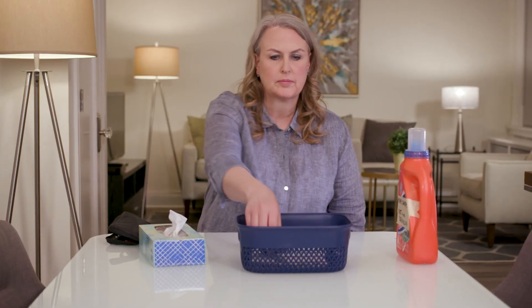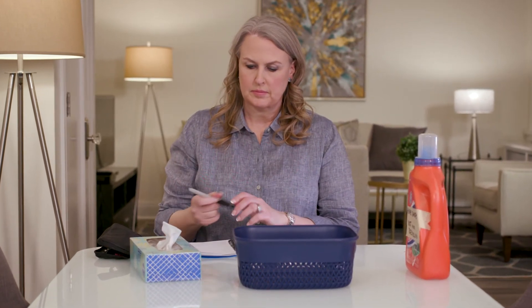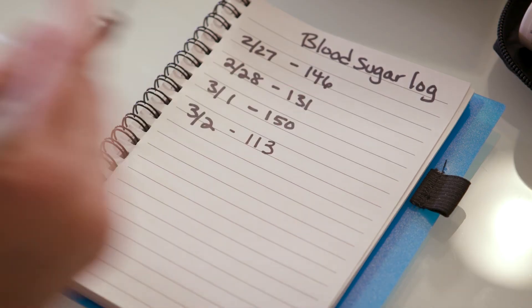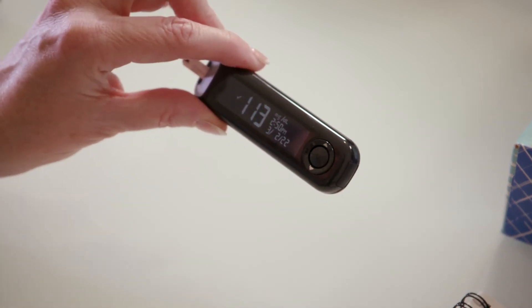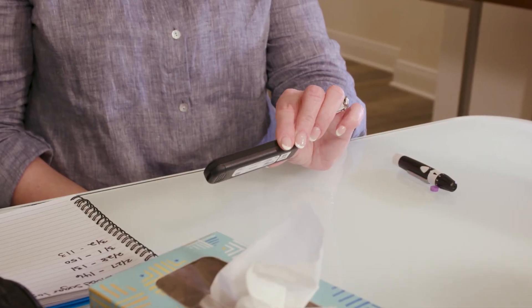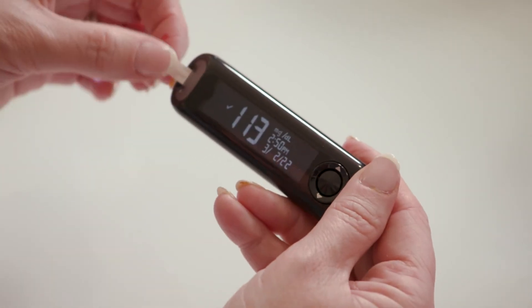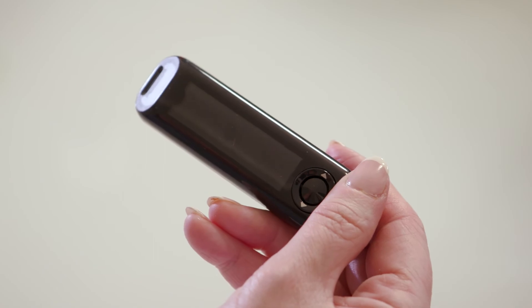Once you know your blood sugar level, record it in your log before taking out the test strip. Make sure your meter is right side up when you read it. The result will stay on the meter screen until you remove the test strip or for three minutes. To remove the test strip from the meter, pull it firmly out and throw it away in the trash.